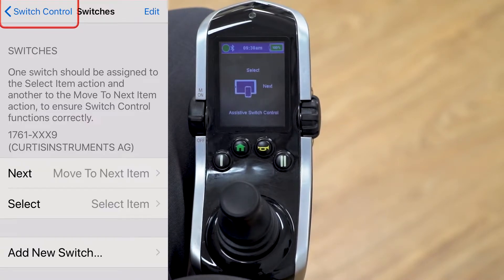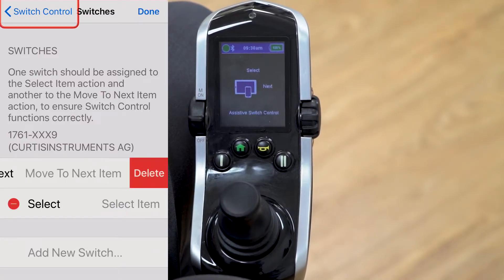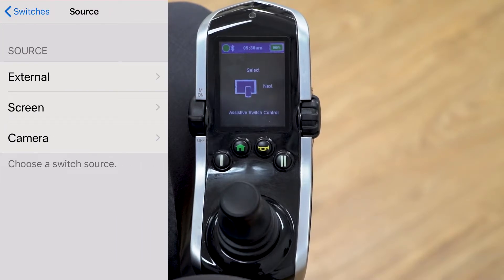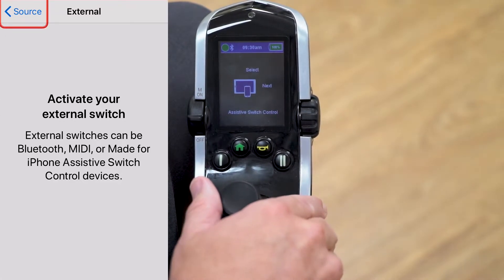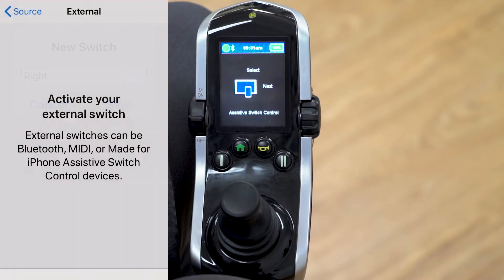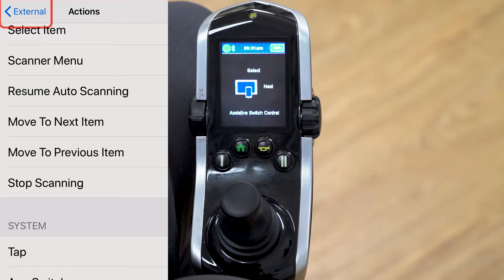It defaults to move to next item and select item, but here's a slightly different setup. With the Q-Logic 3 system, you can do two switch hits per direction — a short and a long command — giving you up to eight different commands. We'll set up four commands to start. Click add a new switch, choose external, give a right command on the joystick, name it 'right,' save it, and assign it the function move to next item.